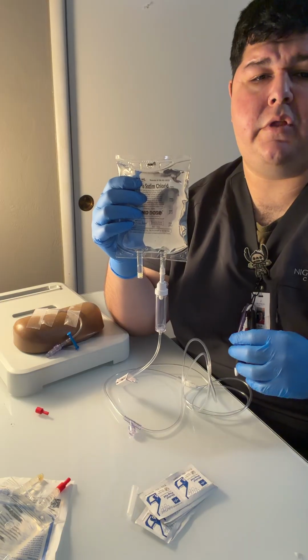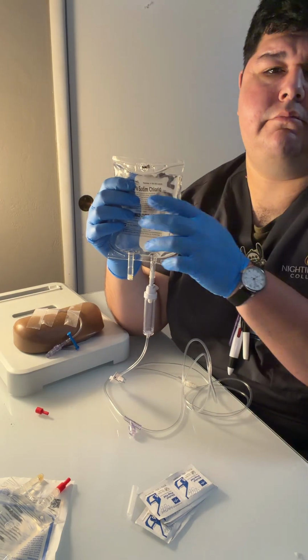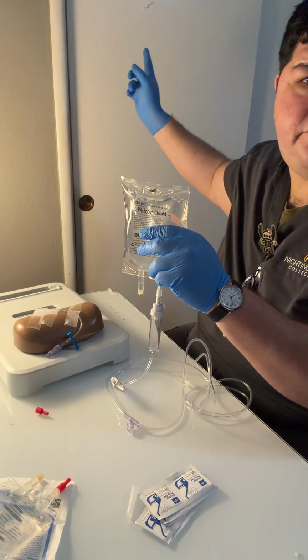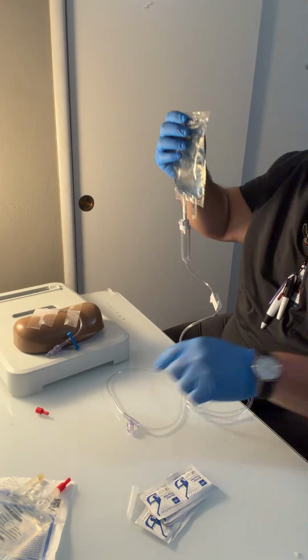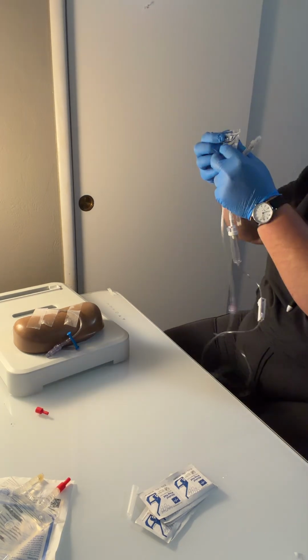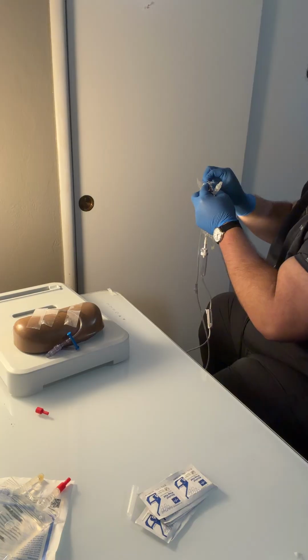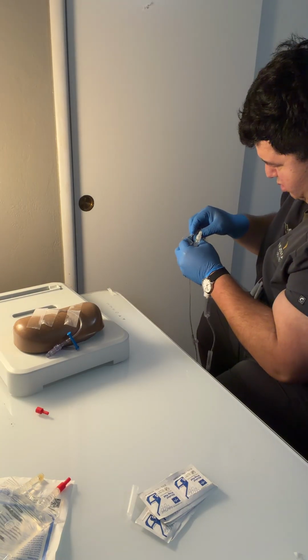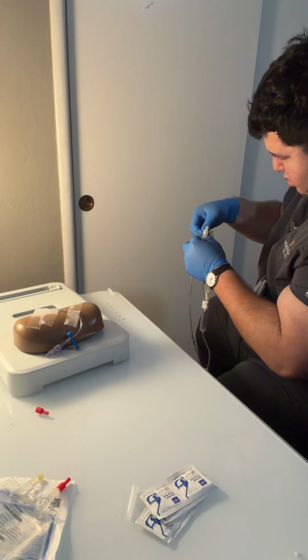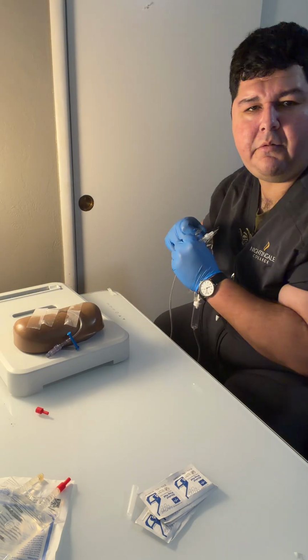And since I know that I'm going to be doing a piggyback, I have my hangers here. I don't know if they can be seen. So I'm going to go ahead and get my end. Sorry, bear with me, the hole's not really punched through.